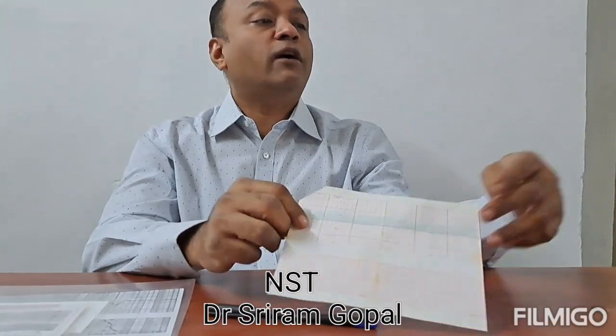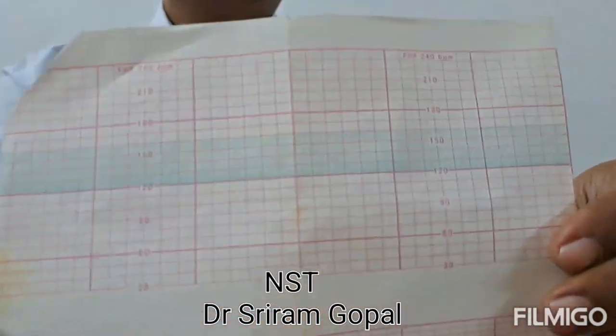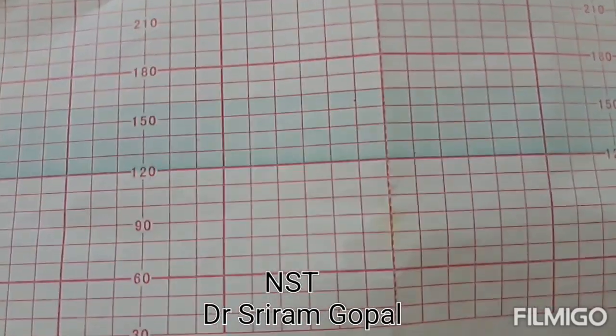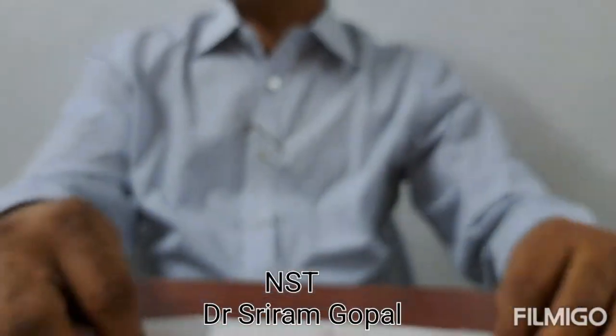Okay, so you have a paper with you. So there is a band here. What is the band between? The band is between 120 to 160. So if you take a tracing and the entire tracing is along this green band, that means the baby's baseline heart rate is good. So the first thing is the baseline heart rate.